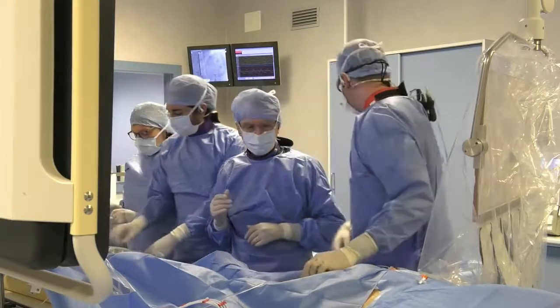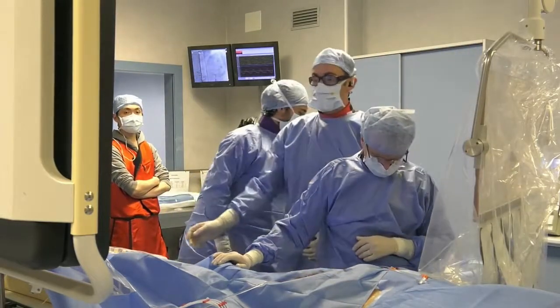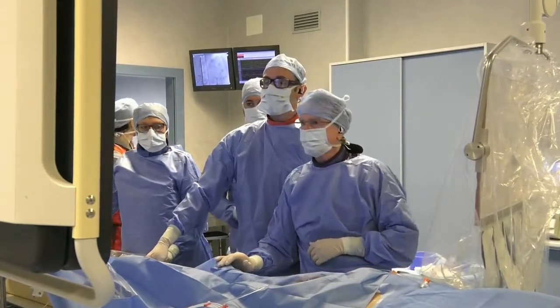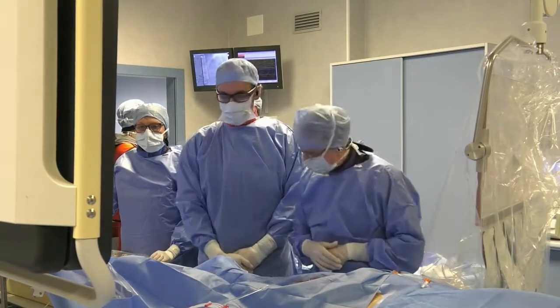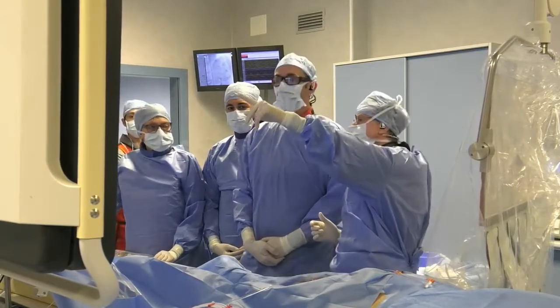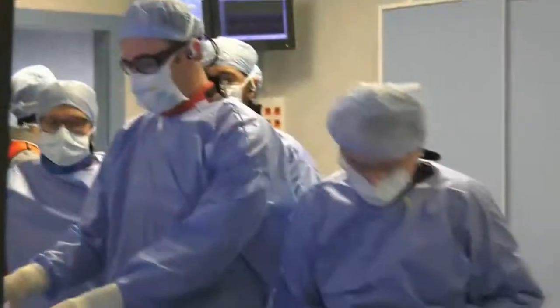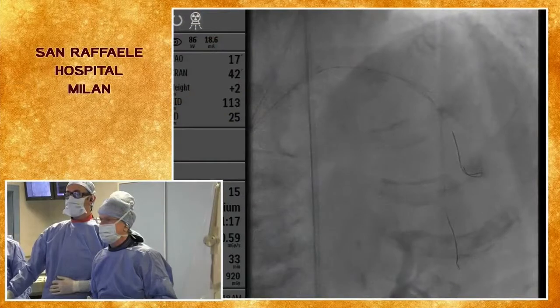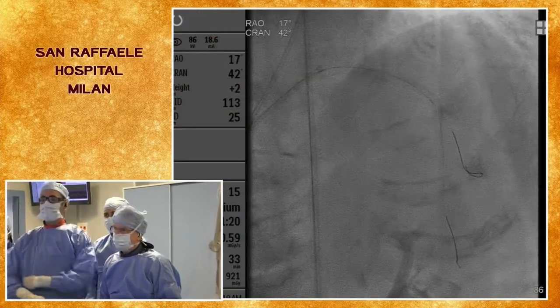So what did you do, Lorenzo? So I implanted a 2.5 by 18 drug-eluting stent, and I overlapped it with a 3.0 by 38 drug-eluting stent. We post-dilated with a 3.0 and 3.5 at high pressure, and we're just there. So you just did everything, eh? I haven't checked yet. I must say that the 2.5 balloon distally crossed easily with the Grand Slam in the diagonal. You still have the Grand Slam in the diagonal. Yeah. Let's take a film. You want to give nitro first? Oh, it's okay. Let's take a film.